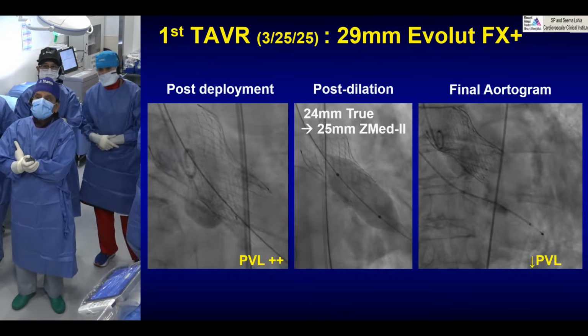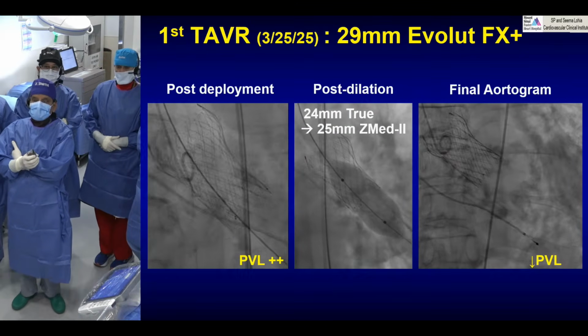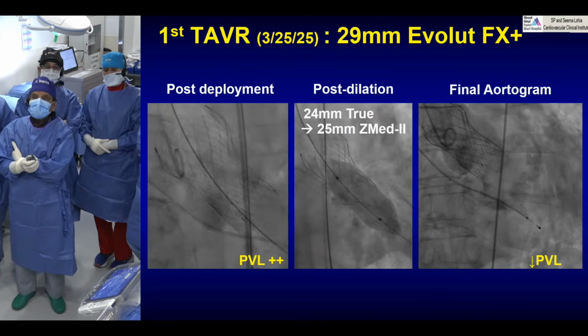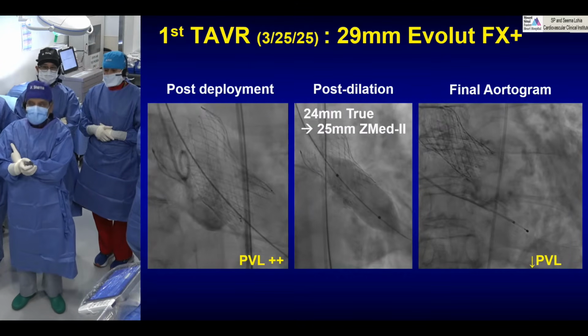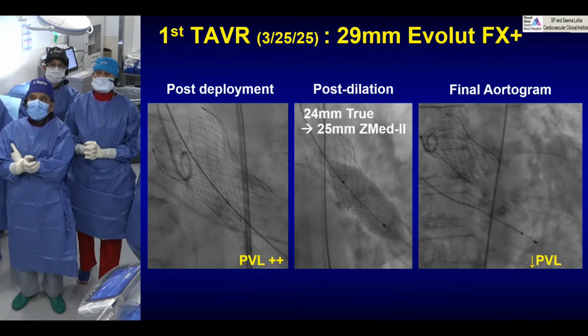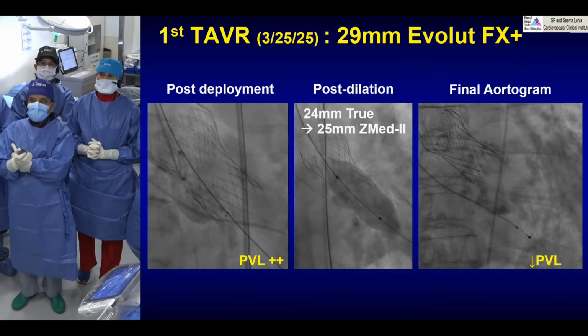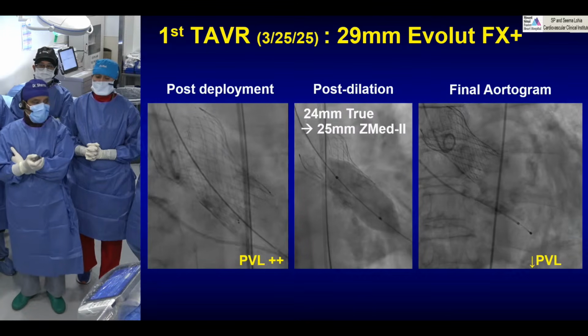So when you see the PVL, when one is echo criteria, right? When you're seeing them at 30 days and subsequently, what are the other criteria that you're going to use? Let's ask Dr. Larakas, who is on the echo side, because let's say you left it with a mild PVL. I mean, anytime it's a little more than mild, it will not come out of the room.